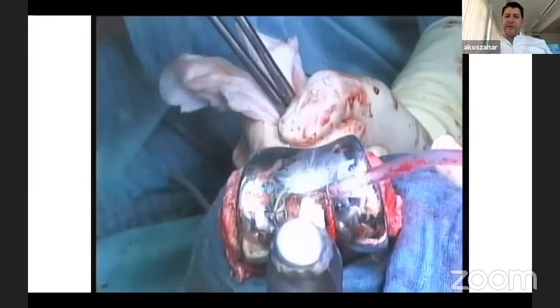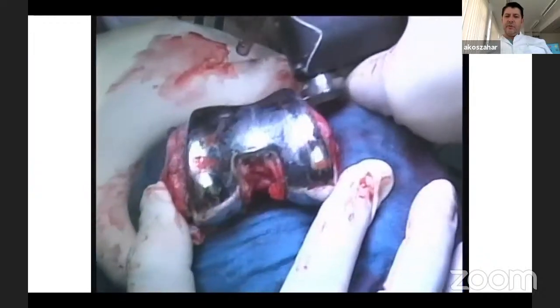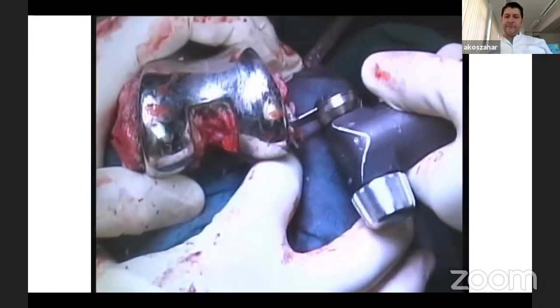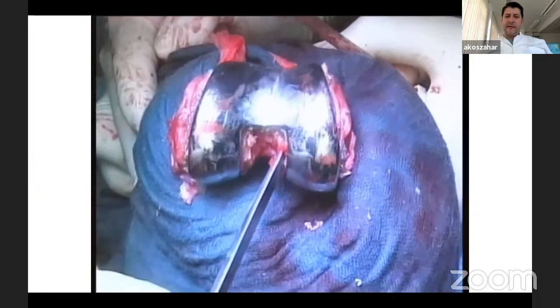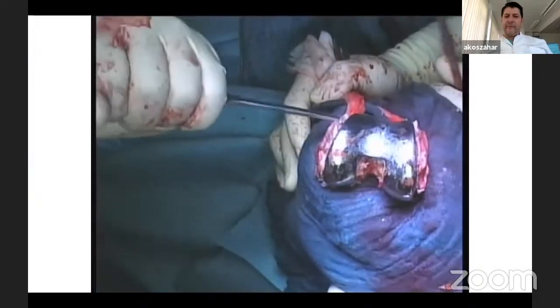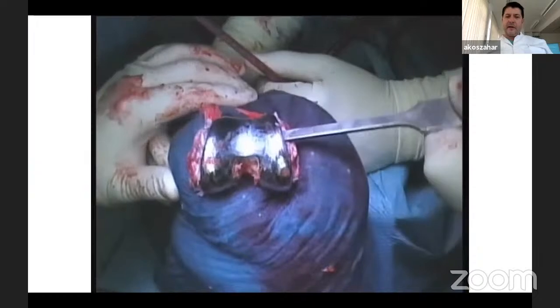And then you can use chisels and power saws to remove the implant from the bone without any bone loss. And when you are lucky and you were meticulous and not too aggressive with your chisel, then you can remove the implant without any massive bone loss. And this is how to mobilize.